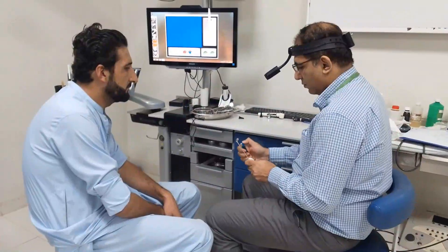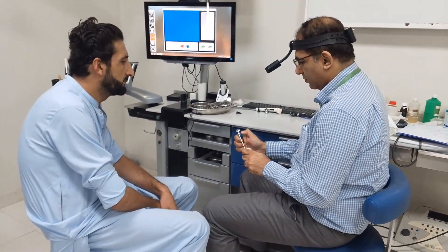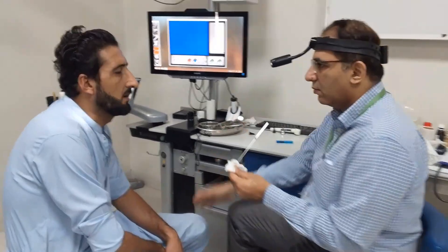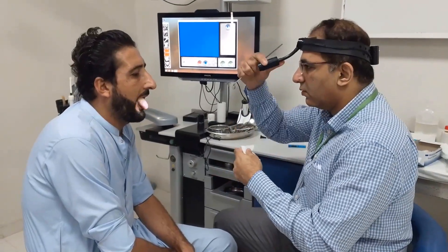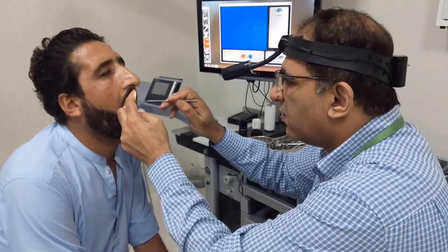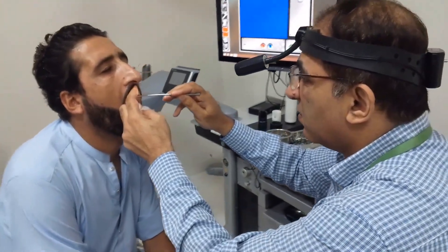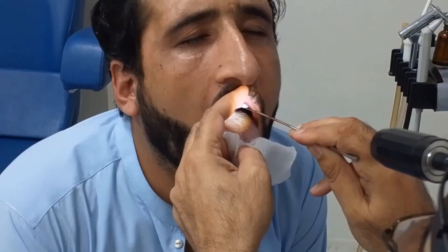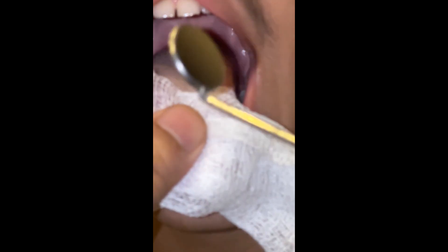This is the procedure of indirect laryngoscopy. I am heating the mirror end with a lighter — now I will first check it on myself. It is not too hot, then I check it on the patient. Now I switch on the light, get into proper position, and ask the patient to open the mouth. I hold the tongue between thumb and middle finger; the index finger is used to retract the upper lip. I ask the patient to say 'E.' The patient pronounces 'E' and I am able to visualize structures in the mirror. Once I have examined all the structures and assessed mobility, the procedure is over. In the close view, the tongue is held and the mirror lifts the uvula; the patient says 'E' and we observe the movement of the vocal cords.